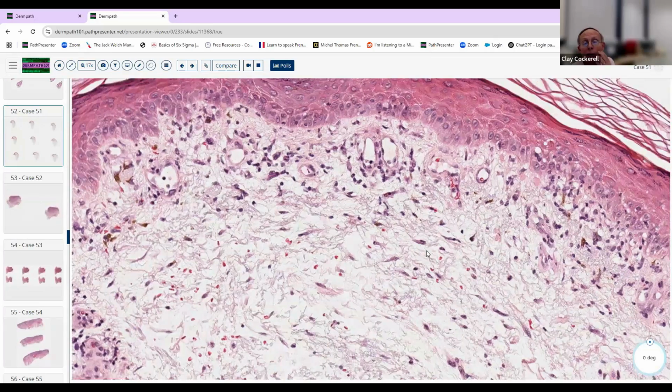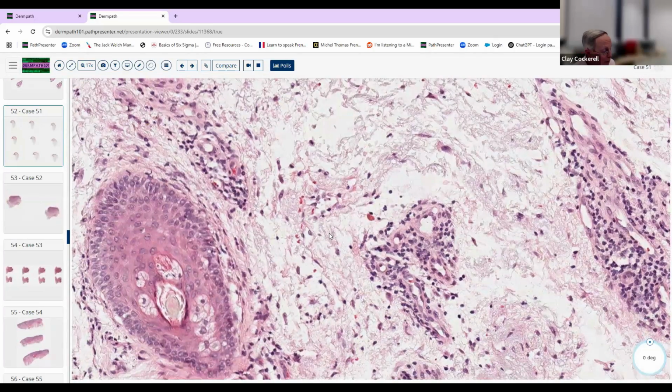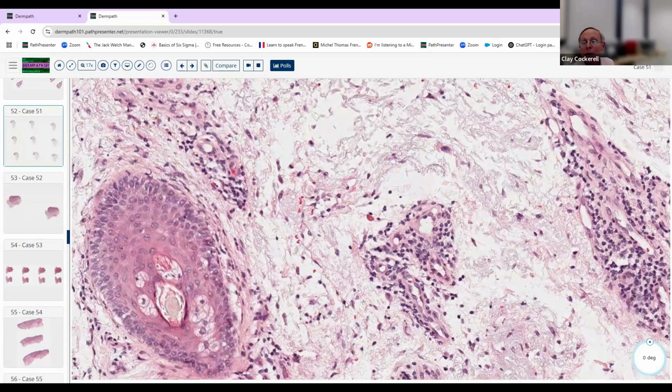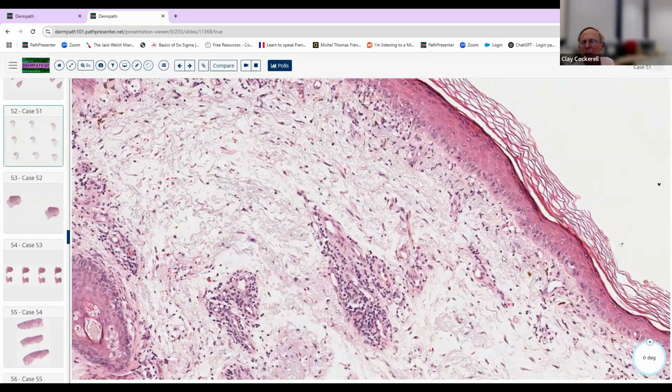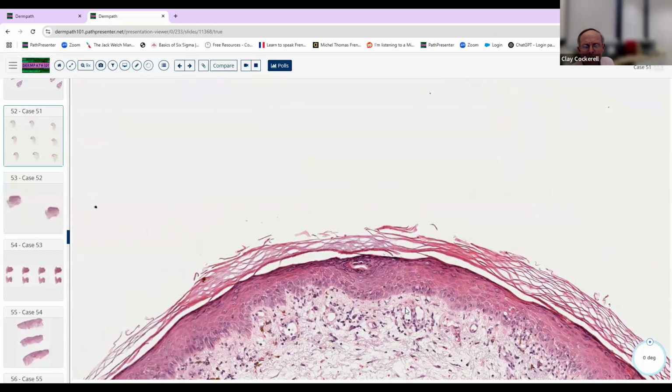Not all of this is elastosis. Some of it is also mucin as well down in this area. So your choices here, the only one that might confuse you might be erythema multiforme, but it really didn't have it. It's got effacement of the epidermal rete. It's got a few dyskeratotic keratinocytes, not the same degree that we saw in the EM. This is a more chronic process.